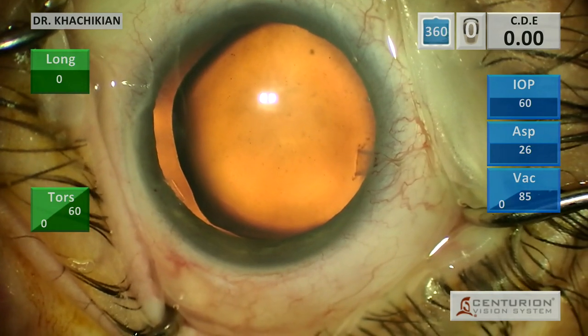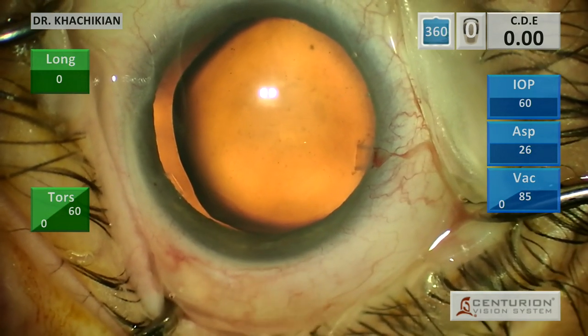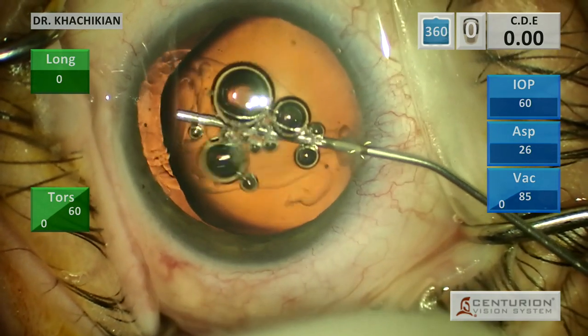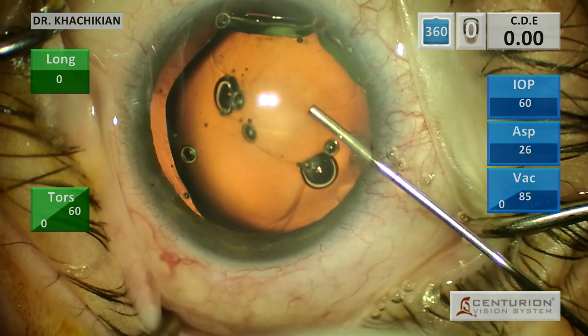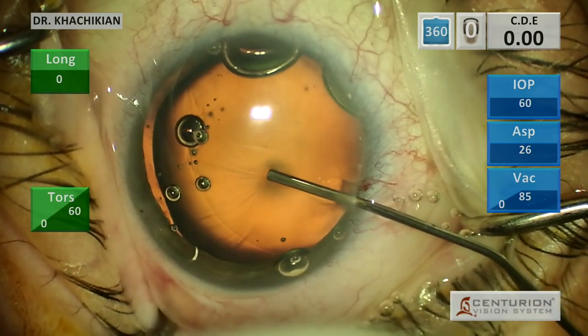When I initially saw this patient in the clinic, I don't think I recognized that he had these loose superior zonules or superior zonular loss. But when I got into the operating room with good dilation - I just don't think he was dilated enough in clinic - I was like, okay, we've got a more complex case here.